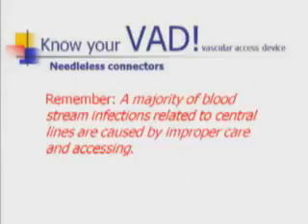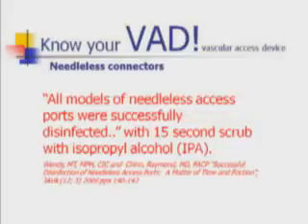Some positive displacement connectors have been shown to have higher rates of bacterial transfer through them, more dead and priming space for biofilm and fibrin to form, and have been implicated in increased catheter-associated bloodstream infections in certain studies. They also require significant changes in flushing technique.